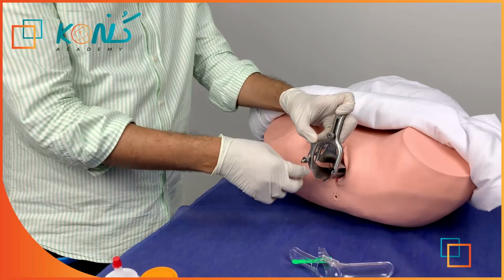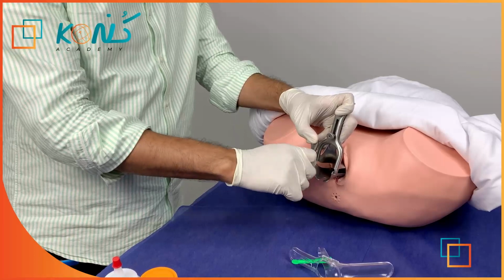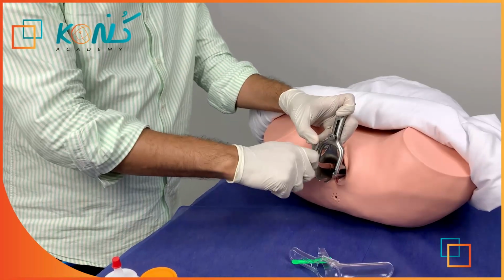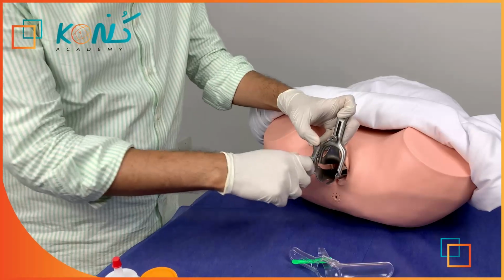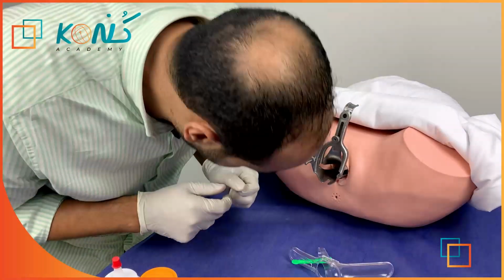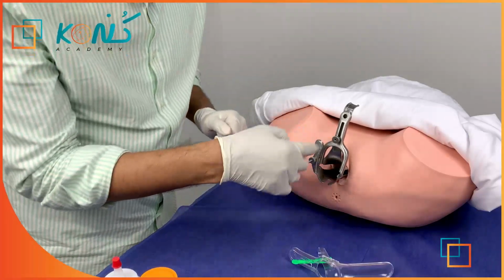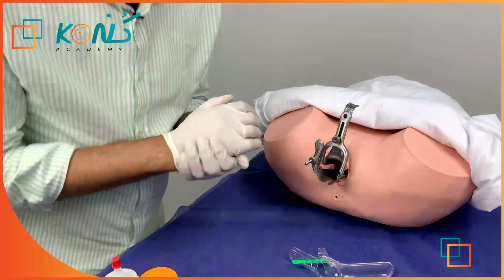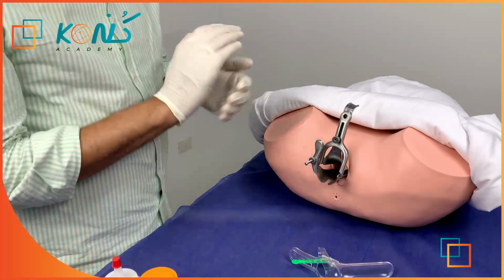After opening it, we will tighten this screw again like this to maintain the speculum open. Right now, the speculum is open and I can totally visualize the cervix of my patient. These are the steps of the speculum examination.